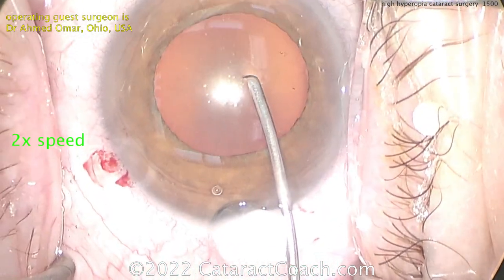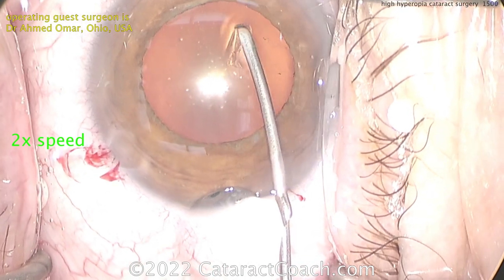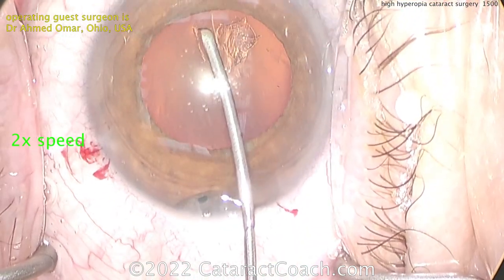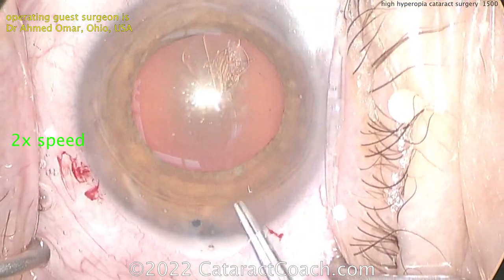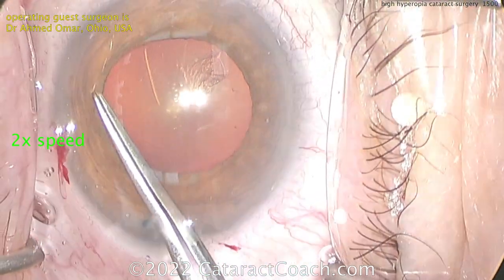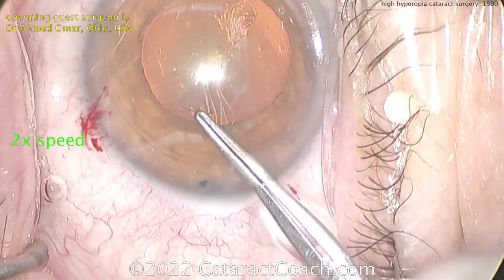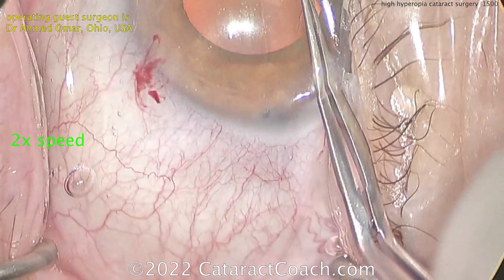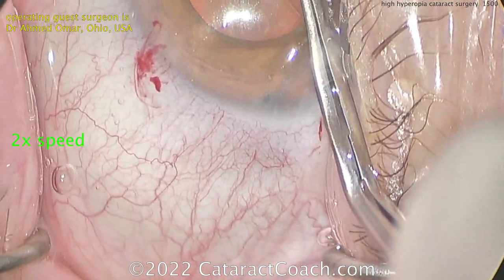Here comes the rhexis. Notice how, even with that thin cytotome going into the eye, viscoelastic will want to leak out. This is a shallow anterior chamber to begin with, and in a case like this there's going to be some posterior pressure. You may want to loosen up the speculum here. Be very cautious in getting this rhexis done — you don't want it to run out. And again, no pressure, but the patient is monocular. Getting the rhexis done nicely, making it right along the pupil margin in order to get it to be a sufficient size.